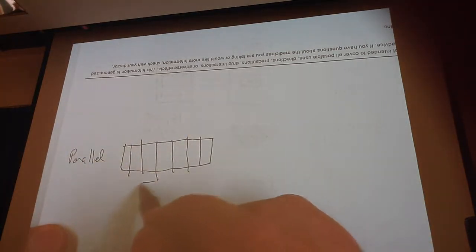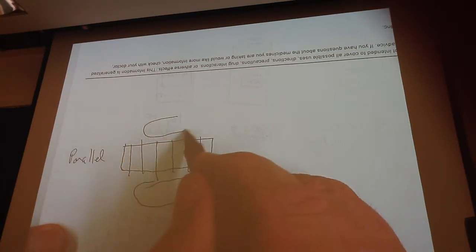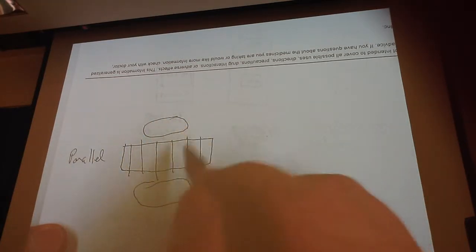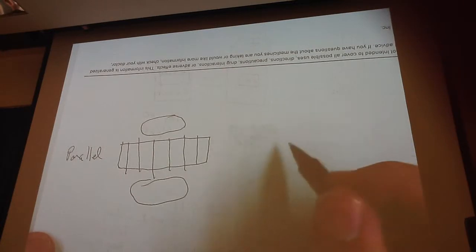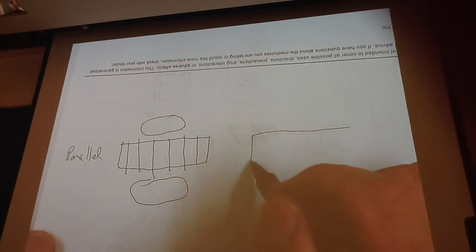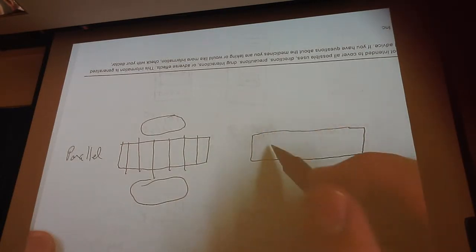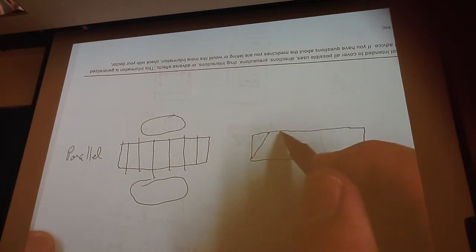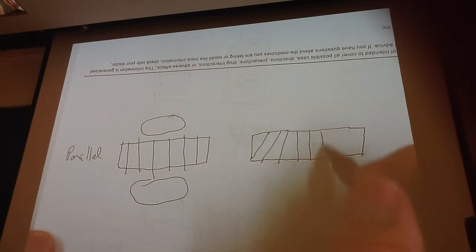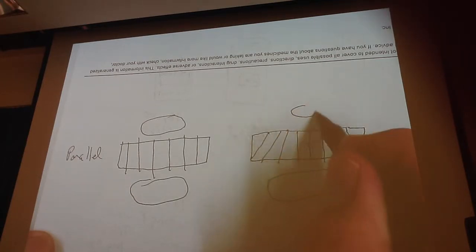Okay, so with a parallel collimator, the organs are going to be the same size, basically. Okay, when they're talking about diverging, they're talking about the septa are angled in. So if you have a large patient, then that's going to minify it.